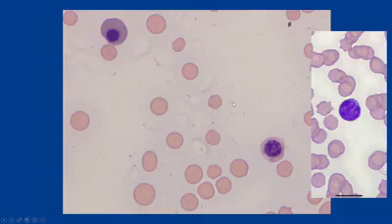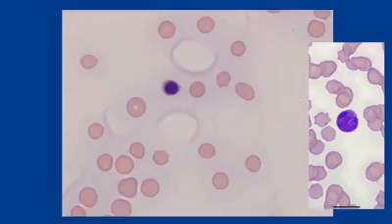It's because the patient had a high protein and they fold on each other. I like to gross the students out and say they look like toenail or fingernail clippings if that helps them remember, but most people don't like that. And here's another area, again with one of these nucleated red blood cells, and lots of protein crescents in the background. So this patient has a pretty notable metarubricytosis, or increase in nucleated red blood cells in circulation.